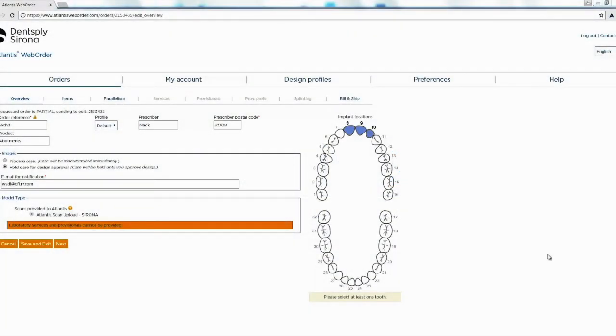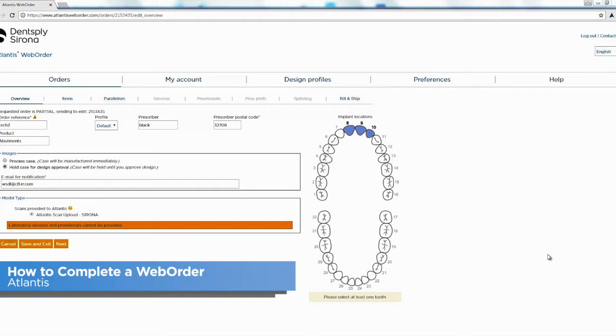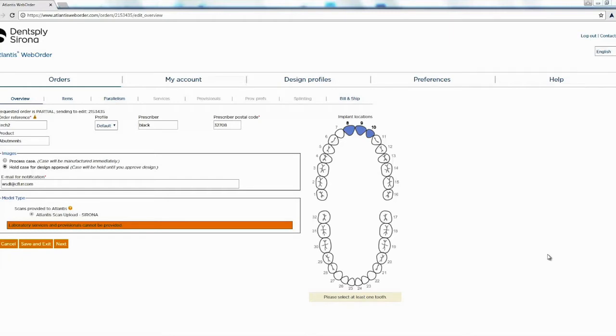Hello this is Jay Black with Tekken 2. In this video we're going to show how to fill out our Atlantis web order. In the previous video we showed how to upload our scans. Once we hit send it brings us to this page.